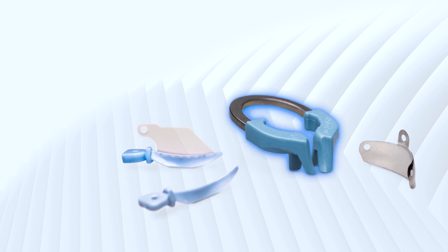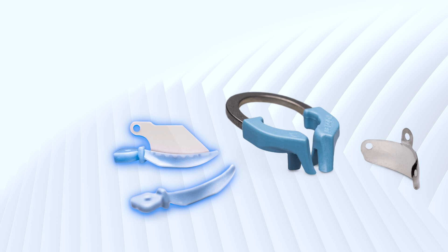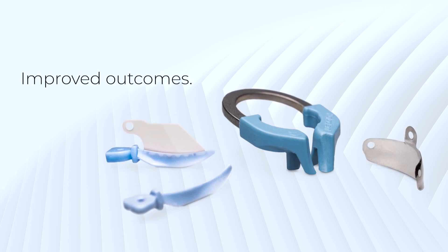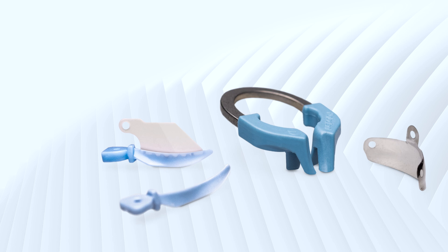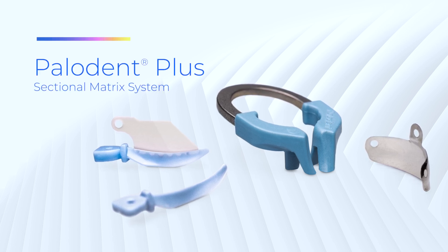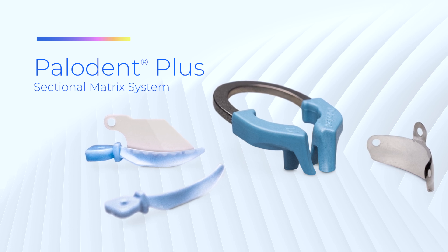Its nickel titanium rings, anatomically shaped matrix bands, and adaptive self-guiding wedges enable the clinician to deliver improved outcomes even when faced with wide cavities and missing cusps. Used in tens of thousands of dental offices and schools globally, better dentistry starts with Palodent Plus.